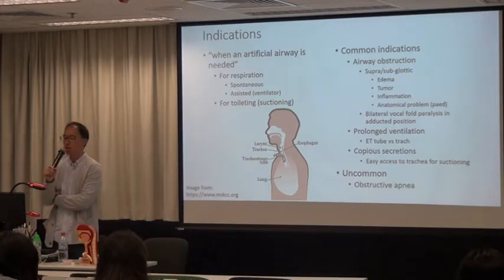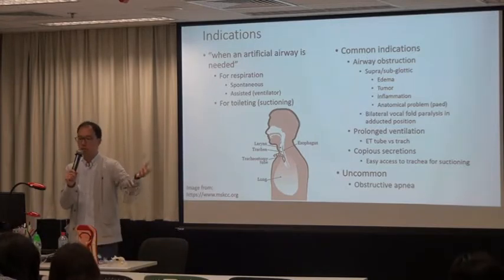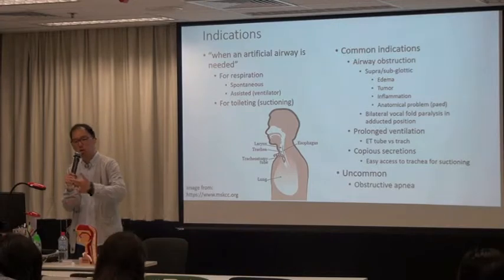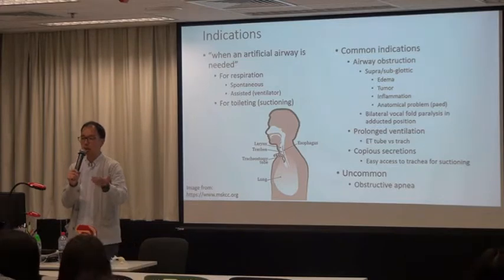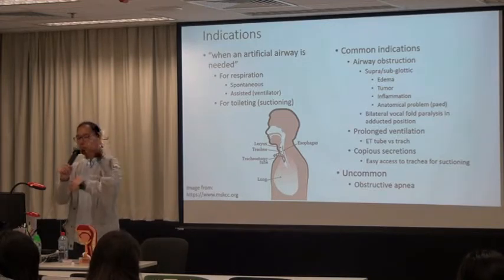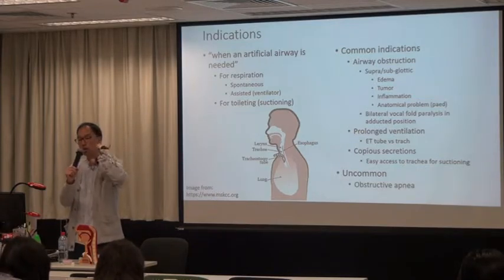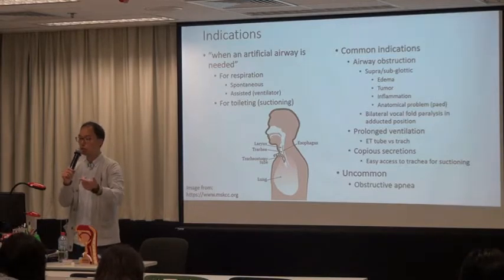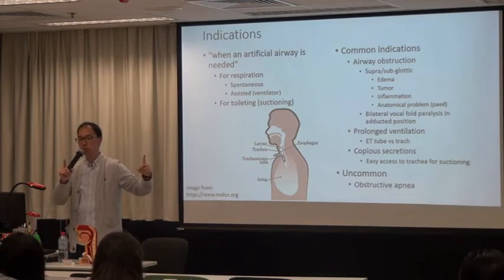If you have a patient who has been on an ET tube for a prolonged period of time, say 7 to 10 days, as compared to someone who hasn't had one, would you predict that there would be any difference in their airway? Think about where the ET tube goes. It goes through the mouth, it passes through the vocal folds, it goes into the airway, right? So it's about 20 something cm long. Okay, it's a long tube.